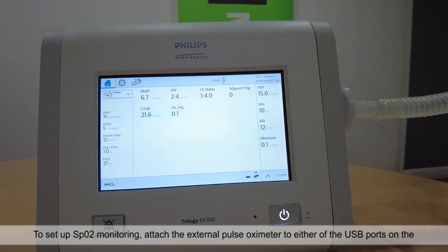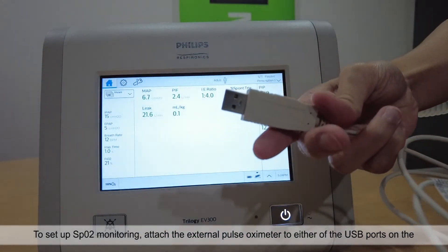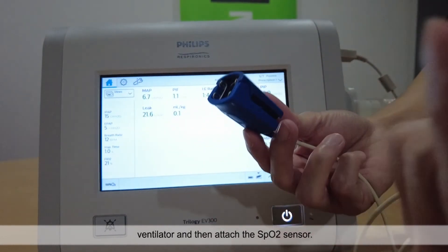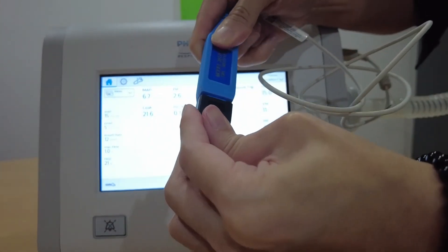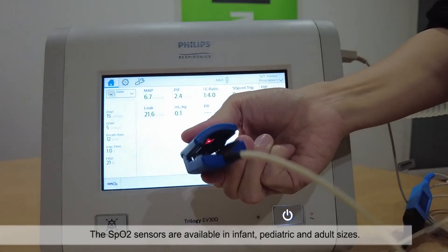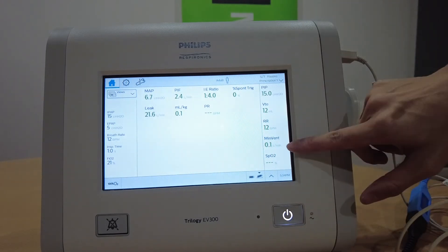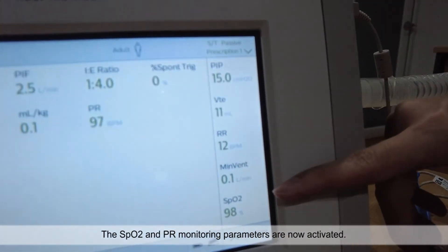To set up SPO2 monitoring, attach the external pulse oximeter to either of the USB ports on the ventilator, and then attach the SPO2 sensor. The SPO2 sensors are available in infant, pediatric and adult sizes. The SPO2 sensors and pulse rate monitoring parameters are now activated.